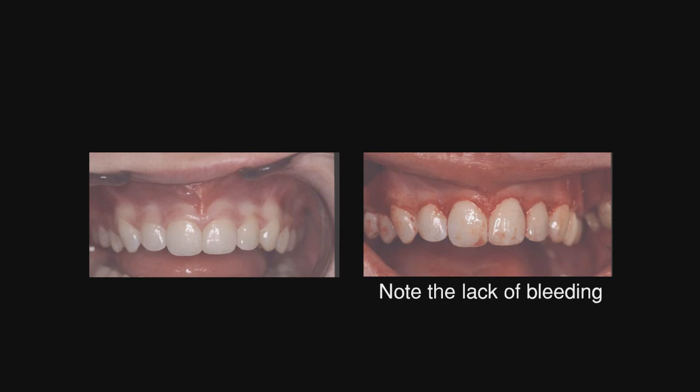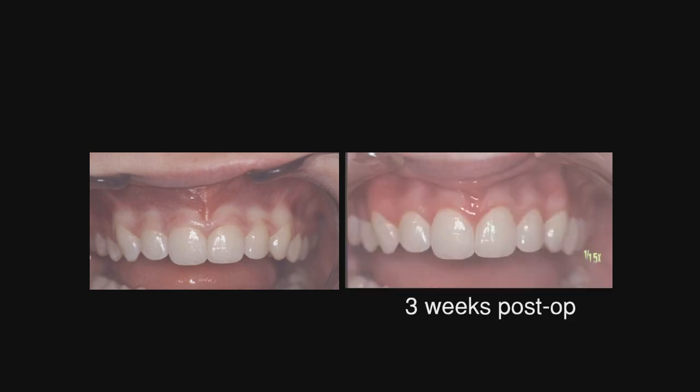So this is where we started, and here's where we have done the radiosurgery, and you will note that there is no bleeding. And on the central, on the right, which is the patient's left, we have a more ideal architecture because the tissue is higher on the distal facial than it is on the mesial facial. Notice on the pre-op that, as I mentioned earlier, the canine looks like a fang, and now we see after treatment the canine does not look like a fang, and yet that was the only tooth that we did not do aesthetic crown lengthening on.